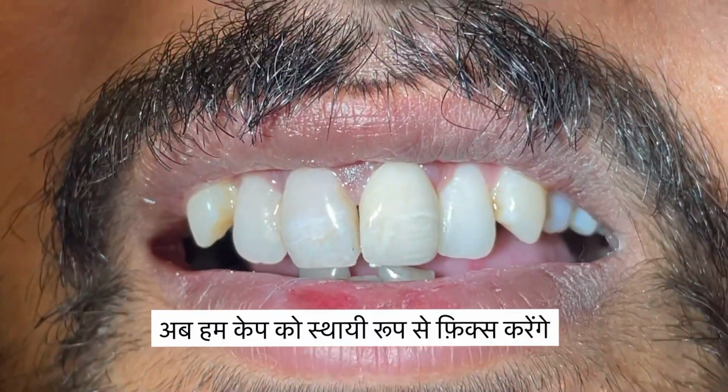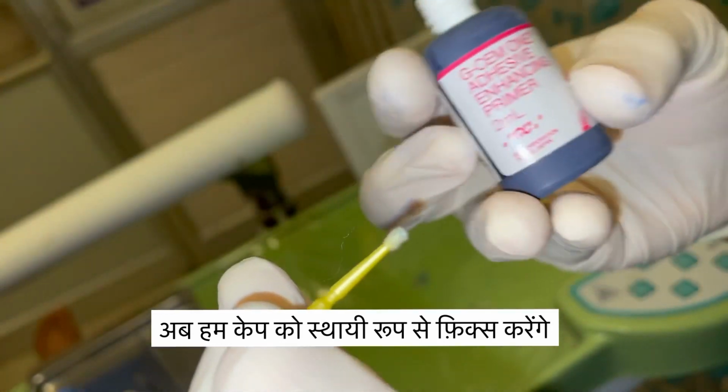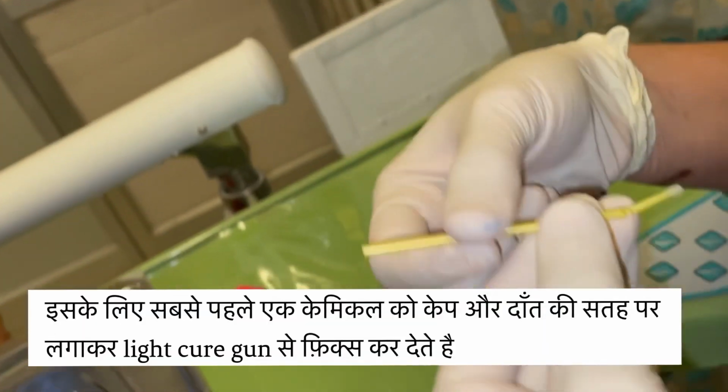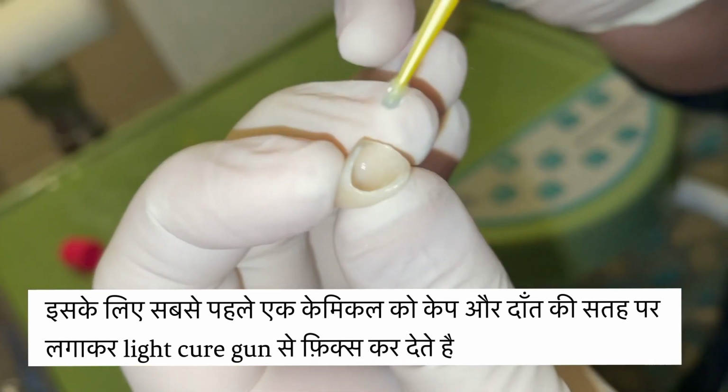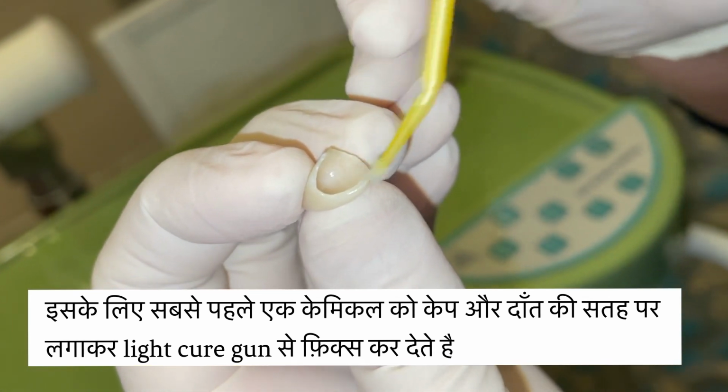For the final fixation of the crown, we put a primer. It's a kind of chemical agent. It's applied on the tooth surface as well as on the cap, and then it's cured with the light cure gun.